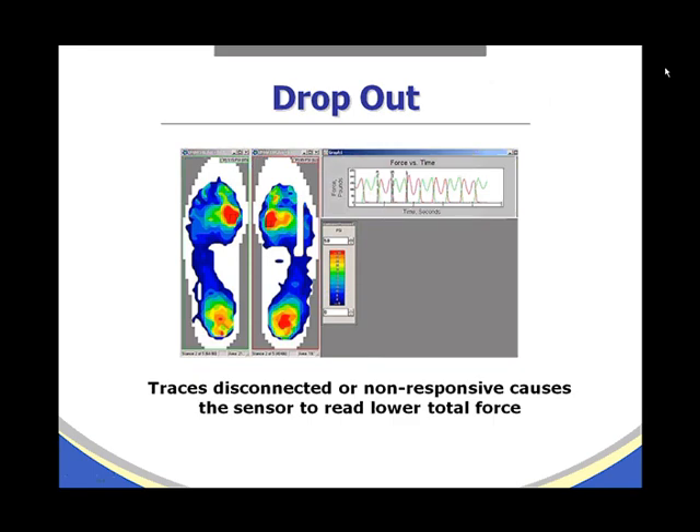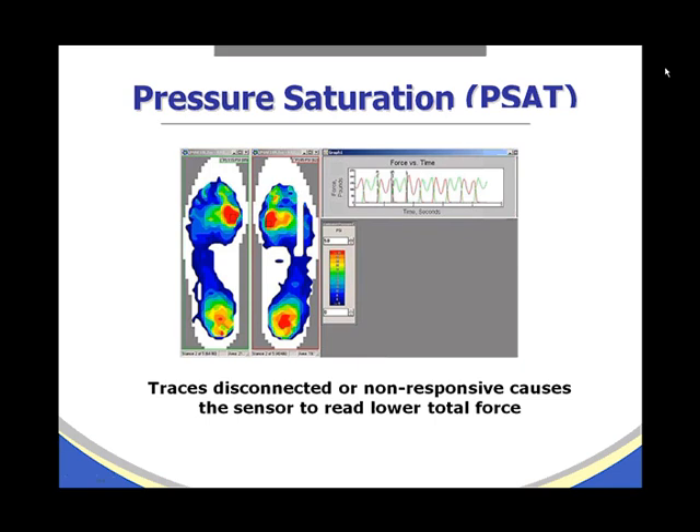Dropout occurs when traces become disconnected or non-responsive, causing the sensor to read lower total force. In this example, looking at the right foot, you can see dropout near the area of the fourth metatarsal. These traces have become non-responsive, will not collect data, and the sensor should be replaced.